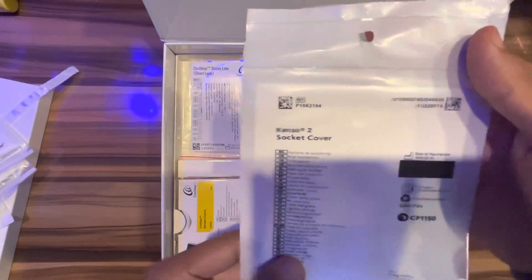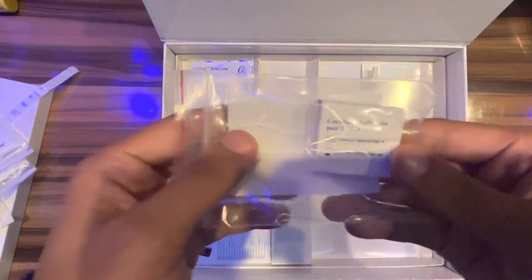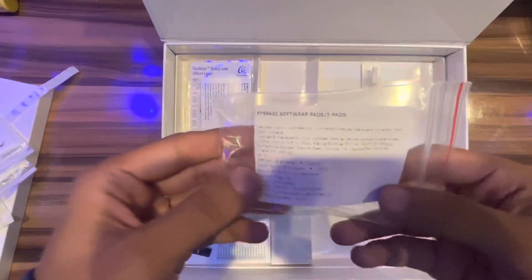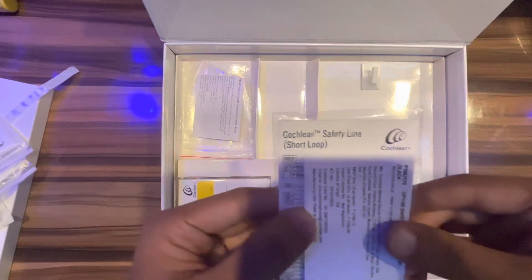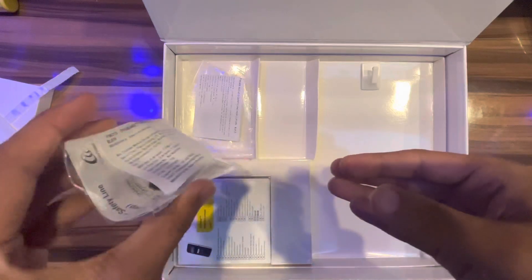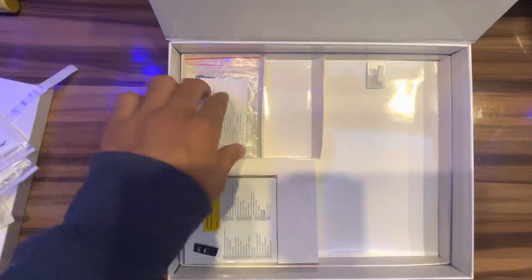This is the Kanso 2 socket cover — very small size, only two pieces. There are also five soft padding pieces. If you are not comfortable wearing the sound processor, use this. This is a safety chain to protect the sound processor from falling down.